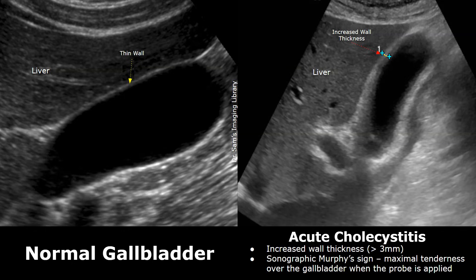Gallstones are the most common cause of cholecystitis, but it can also occur without gallstones, as in this case. This is called acalculous acute cholecystitis.